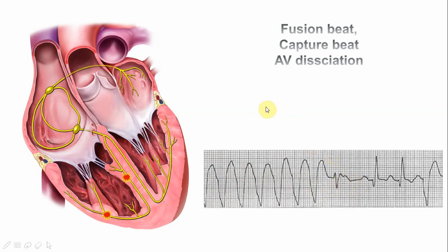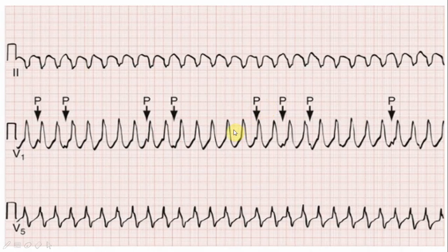Looking at this ECG in lead V1 and V5: there is a wide QRS complex coming at a rate of about 160–170 beats per minute, pretty regular. There is a little notch that is actually a P wave — you can see multiple P waves with no relationship to the QRS complexes. That is classic AV dissociation. With a wide complex tachycardia and AV dissociation, this is VT until proven otherwise.